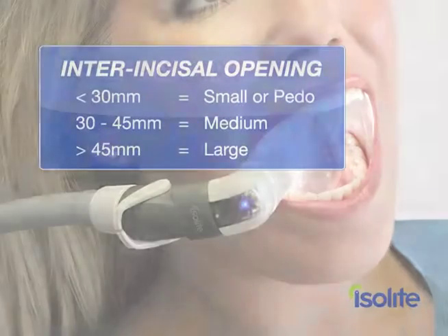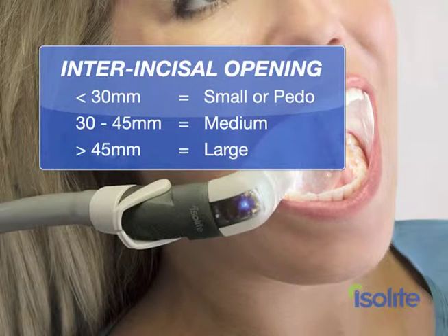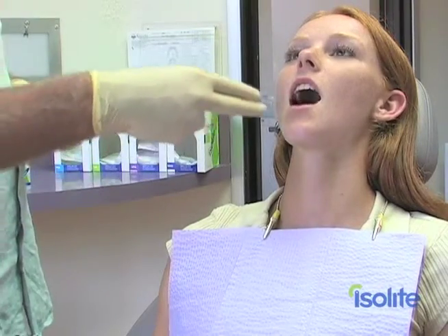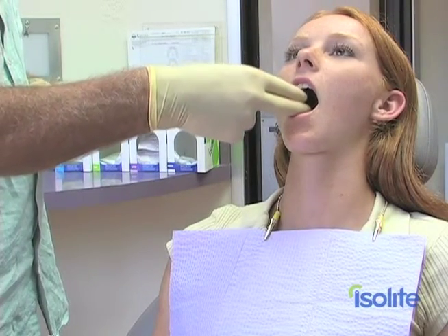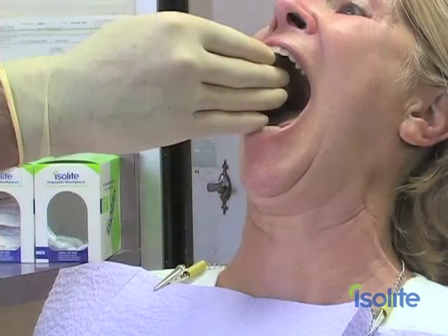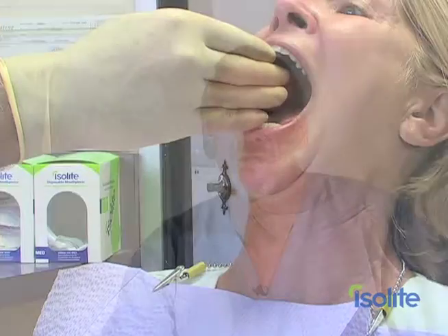Our first step is sizing the proper mouthpiece for the patient. Mouthpiece sizing is determined by interincisal opening, and I want to show you an easy way to use your fingers to quickly determine mouthpiece size — I call it the two-three finger technique. Two fingers of opening requires a small or pediatric size. Three fingers of opening requires a medium. And more than three fingers of opening will require a large size. Sometimes you'll end up in between sizes; in that case always go to the next size up. Bigger usually is better.